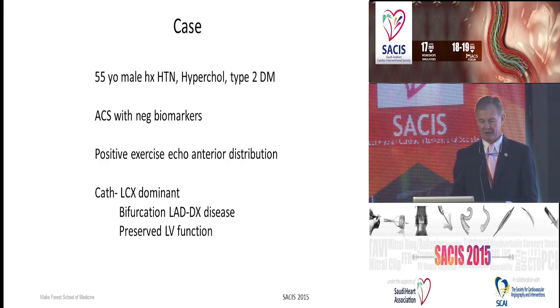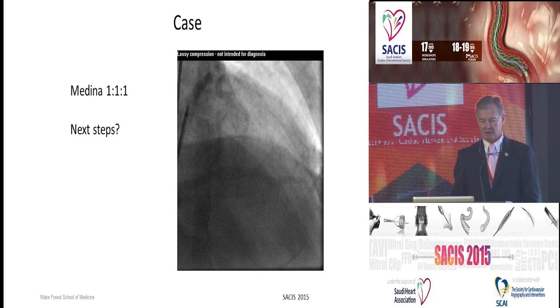And here you can see we have a Medina 111, and this is I guess the grounds at which we're finding ourselves working in the cath lab frequently and trying to decide what the best therapy is. And I'm going to leave you here with this, and we'll come back to the case and show you what we did at the end of this.